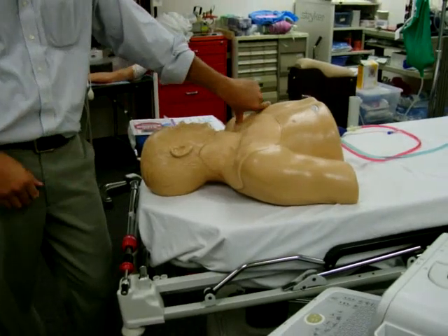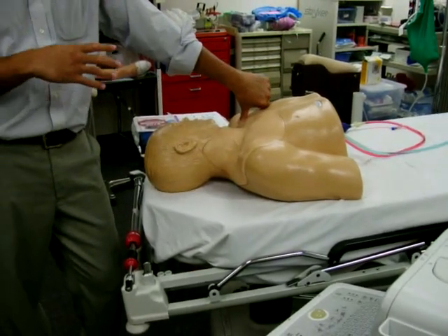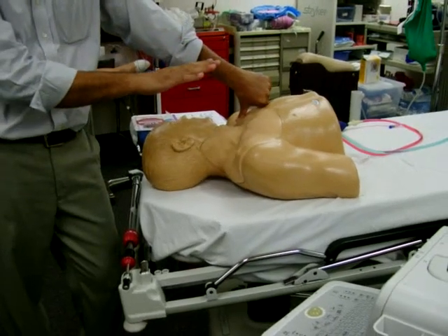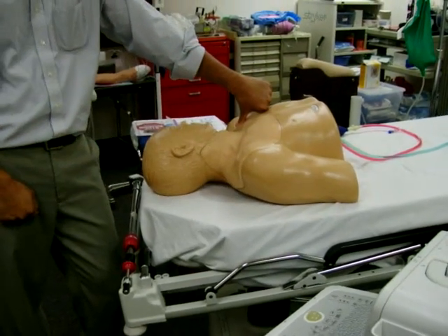Have the head down a little bit. This also prevents air emboli and those sorts of things when you're removing lines. You would remove the line in the same position that you inserted it in.